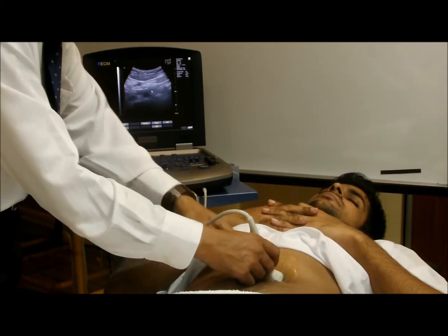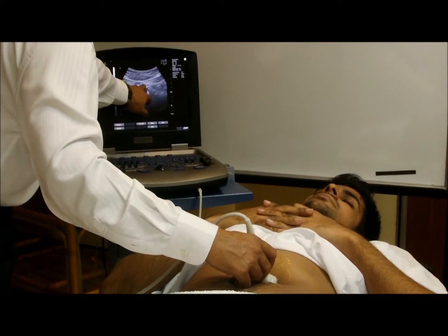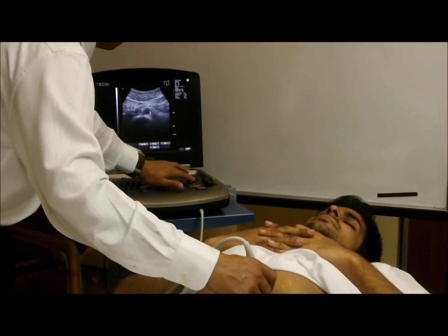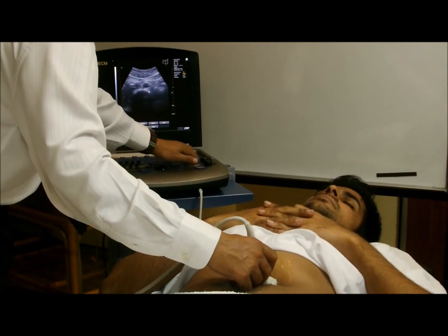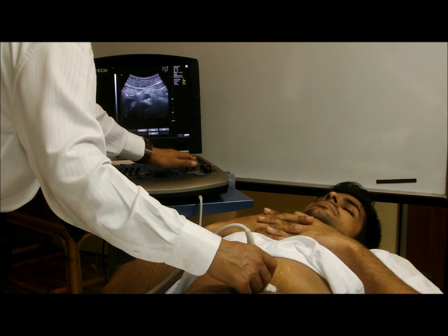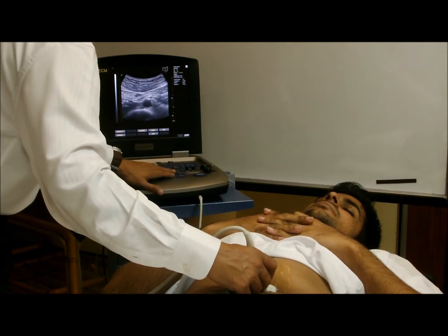If you run the aorta upwards, you will find that it has a branch which is round like that. You see that small one? That is the superior mesenteric artery.